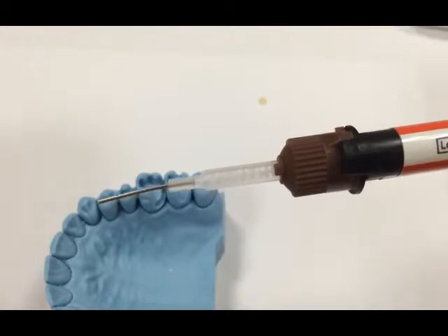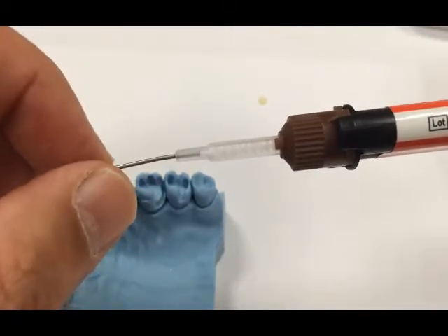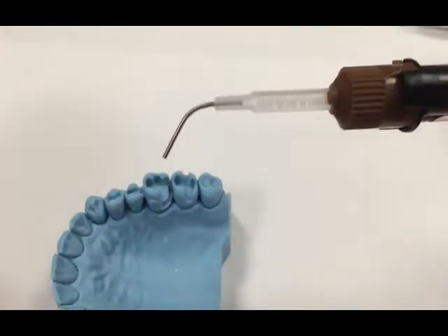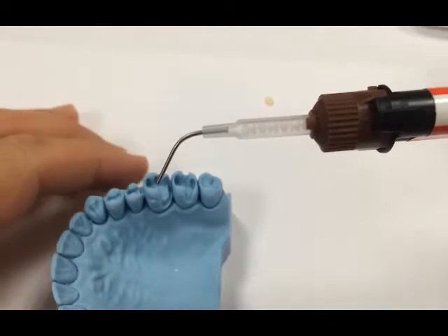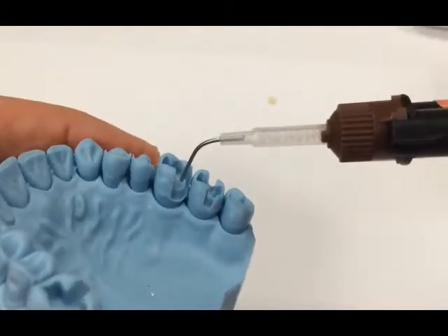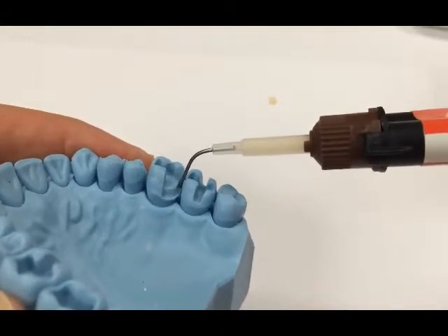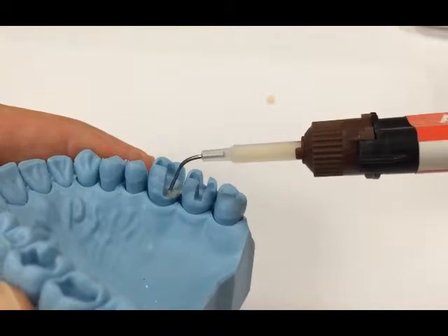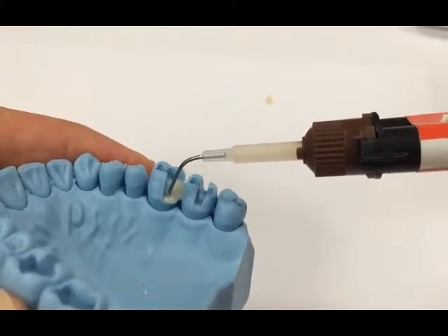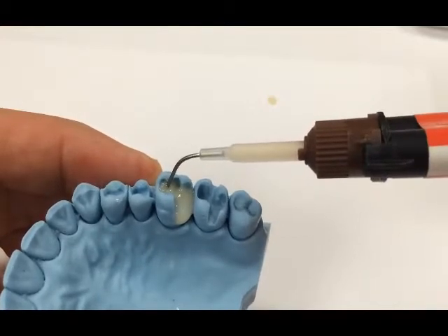Here is a short demonstration of the best application of Activa restorative material into a preparation. We are using the metal cannula tip that comes with the product, which gives complete versatility in bending the tip without crimping the material and stopping the flow. It allows you to get into deep mesial and distal boxes easily. Slowly allow the material to come through the tip, starting in the deepest portion and flowing it around — easy dispensing, being careful not to remove the tip from the material and allowing the material to flow ahead of the tip to create the best results and avoid voids.